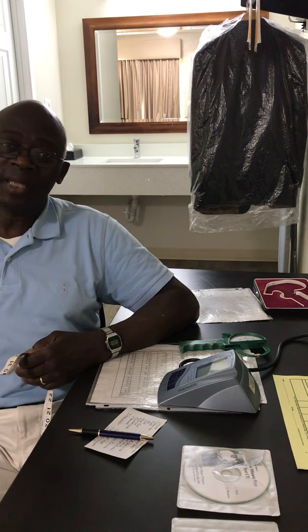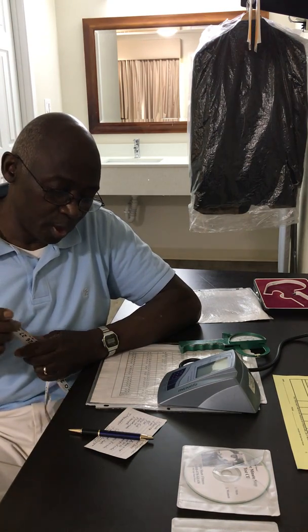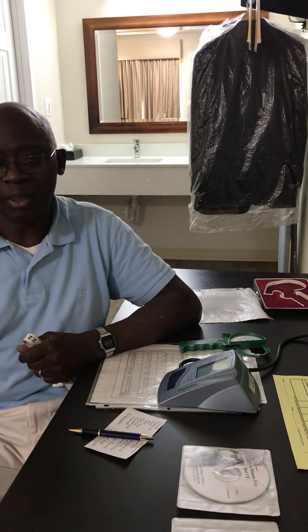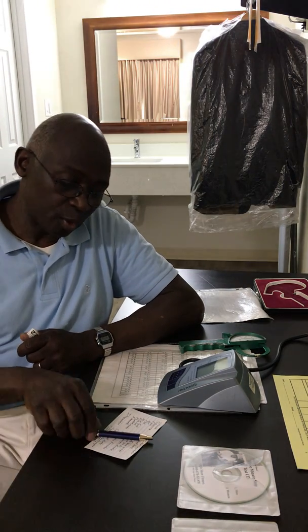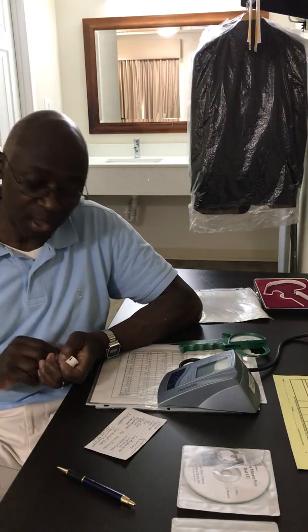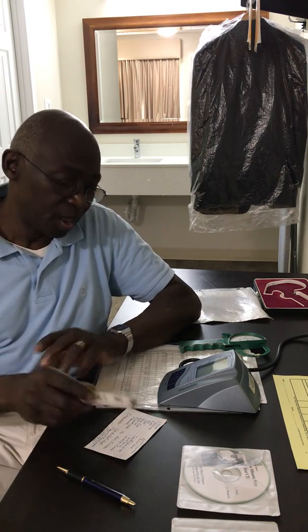After body fat and measurements, I measure strength electronically using an electronic strain gauge with norms established by Dr. Barry Brown of the University of Arkansas, who helped develop the testing program and workouts — particularly for those using the isometric exercise program. Once we've gone through all of these tests, we sit down for what we call an interpretation session.